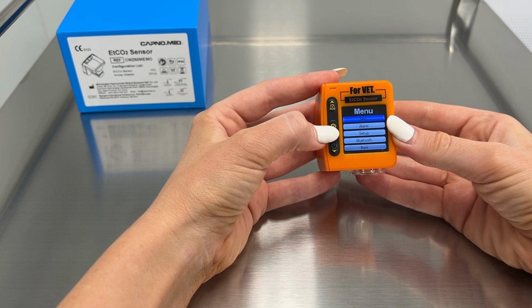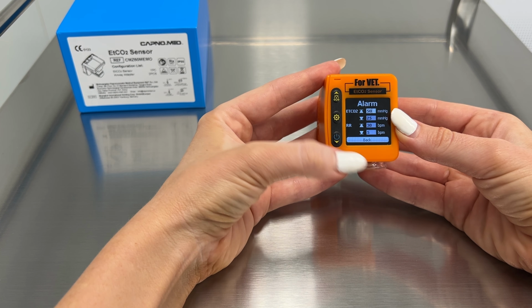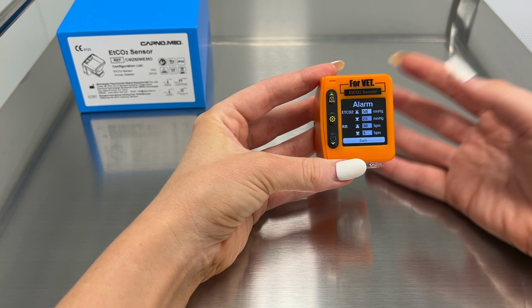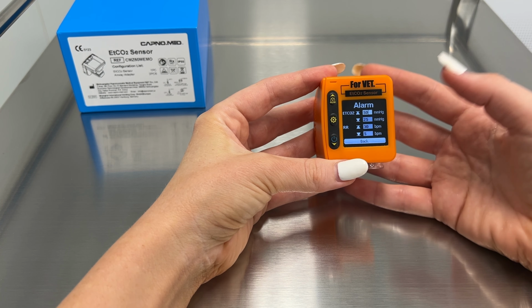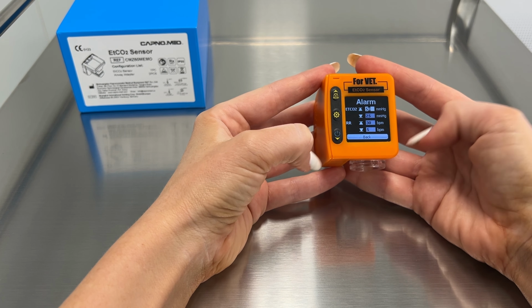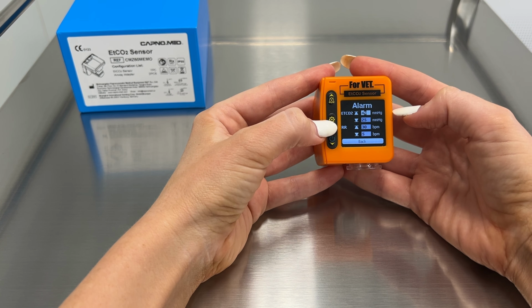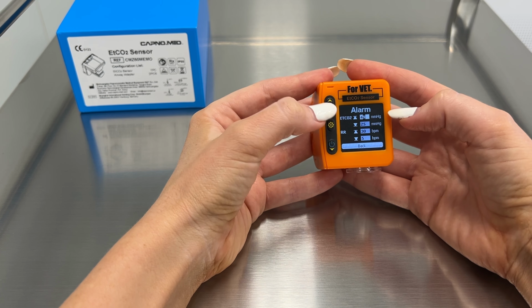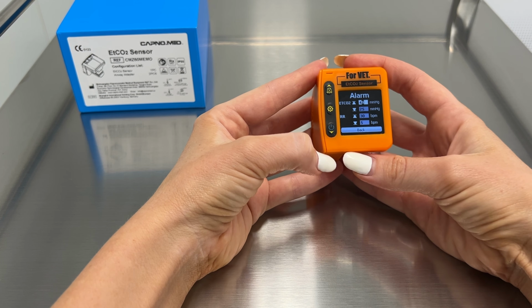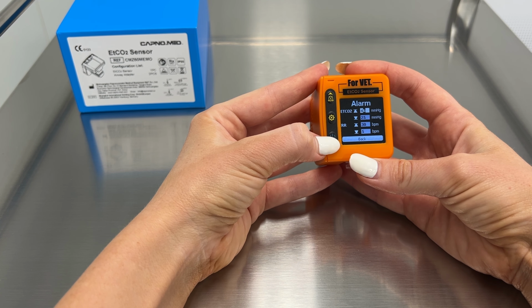If we want to go back to menu and go down to alarm and press select, this is where we can change the normal parameters that we want. This is set at 50, which I would actually like to be at 45. So all I'm going to do is press on that button, press select, and then you're just going to go either down or up. For this one, I want to go down, from 50 to 45. So I'm pressing this down arrow. See, it's going down 47, 46, 45.